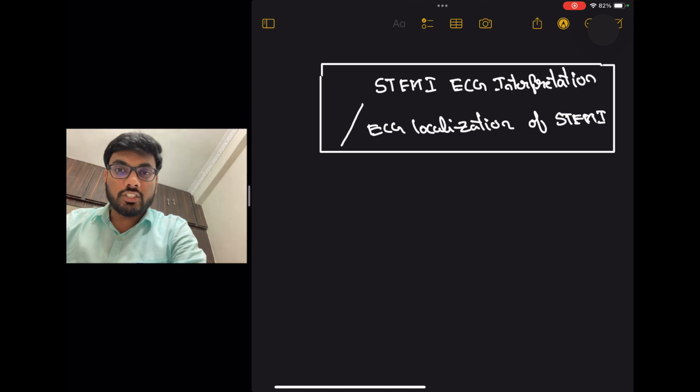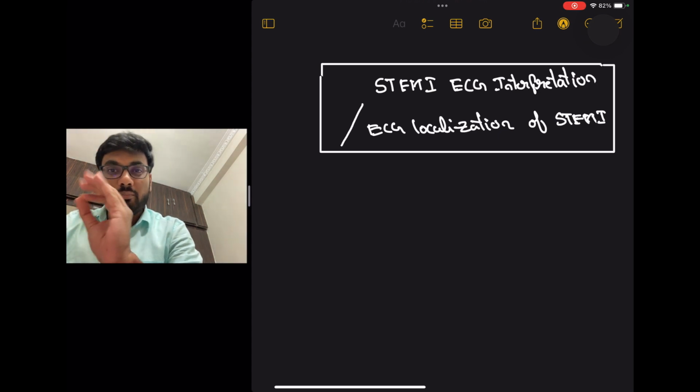Today we are going to discuss ST-elevation myocardial infarction ECG interpretation. By the end of this lecture, you will be able to identify which artery is blocked and what is the site of the artery that is blocked, without angio, simply by the ECG.